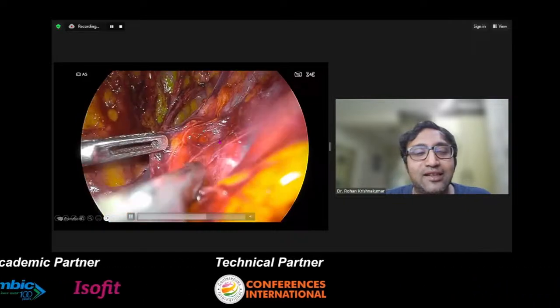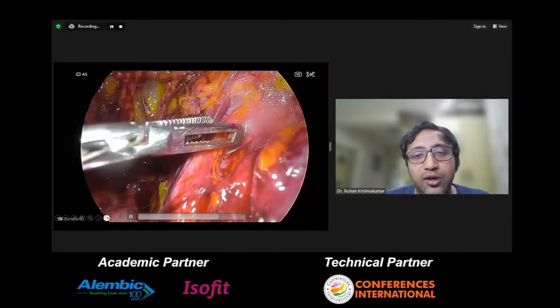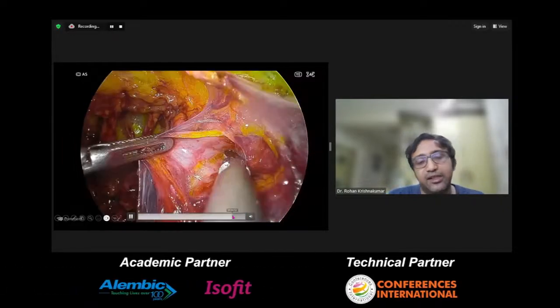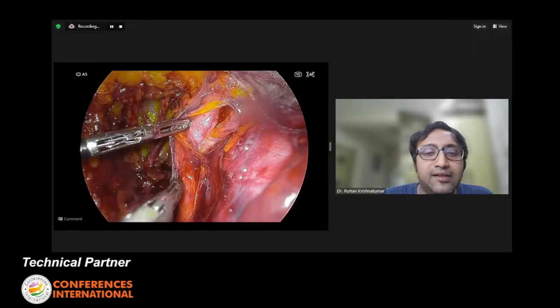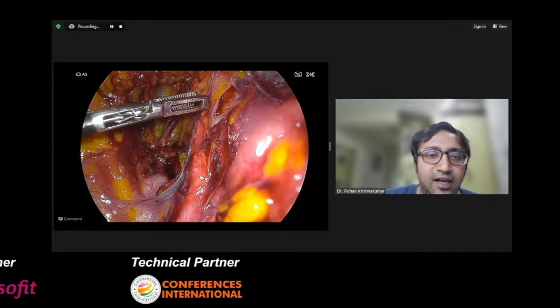So this is how dissecting on the ureter looks. You can see the yellowishness on the ureter indicates that the fascia is still there, and hence you can preserve that fascia very easily. So people who are regularly doing this may say this is not required, but for newcomers to identify this, these camera systems and imaging systems help a lot.